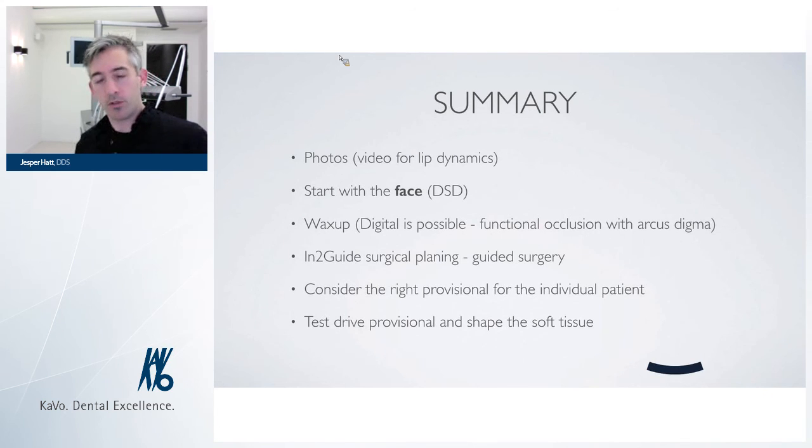I really haven't talked that much about test driving the provisionals, but I really think it's essential to test drive anything we put into the mouth that's expected to last at least 10 to 20 years. If we want something to last that long, we have to test it. So I usually tell my patients when we put in the provisional, if anything breaks in the provisional, it's great. It's really great. It's just composite. It's plastic. We can fix it.